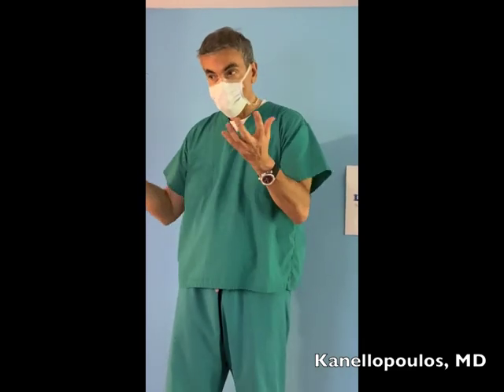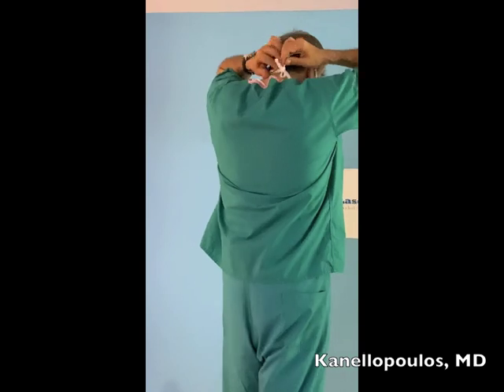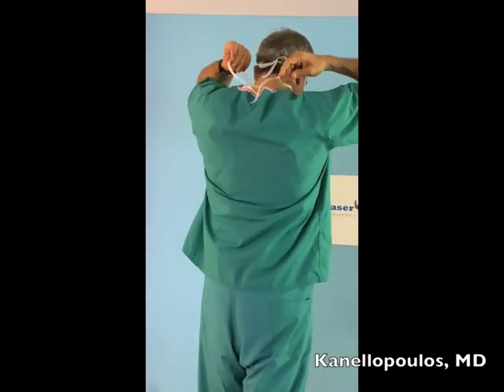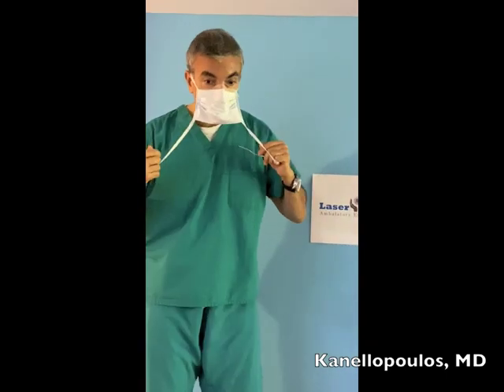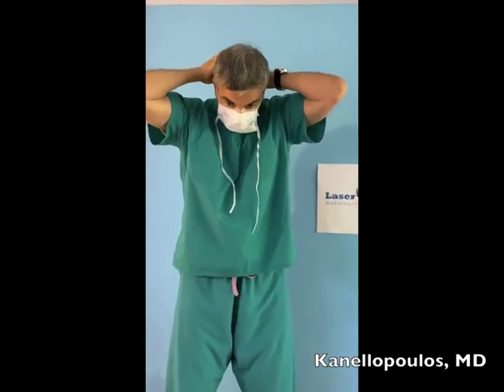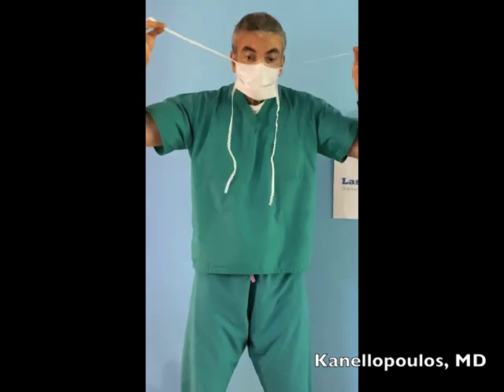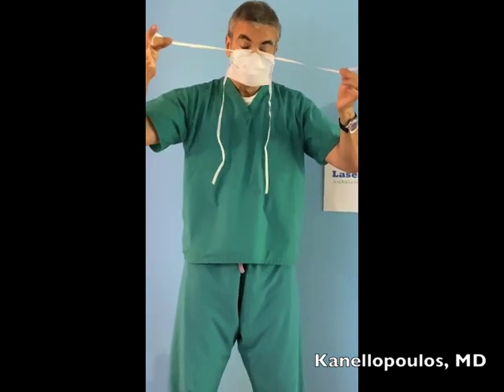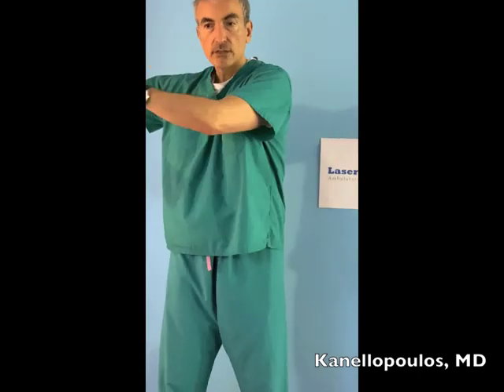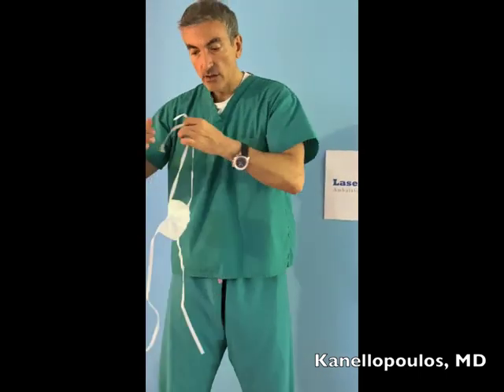To remove the mask: wash your hands or clean your gloves. Go to the lower tie first — remember I made a releasable knot — release that. Then go to the second knot, release that, not touching the surface of the mask. Take off the tape and dispose. If you go and touch the surface of the mask, you'll contaminate yourself.